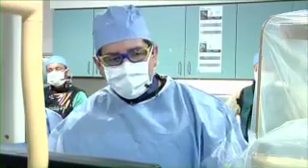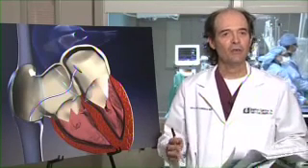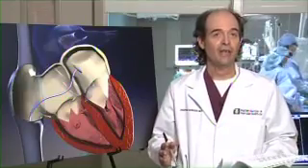I don't know. What do you think, Jonathan? Ron, I agree with what you say. I think there's going to be a segment of patients with migraines that, if we close the PFO, it will make them get better, because some of the patients that you and I have closed say it's just incredible. They don't care that they're not going to have a stroke. They love it that they don't have a migraine. We also have some patients that I close their PFO and I see them in follow-up and now they have headaches, and that's the rare patient. I think there's so much we need to know. We need to continue the research that we're doing here at BCVI and that's being done throughout the world so we can figure out who those patients are that we could help.